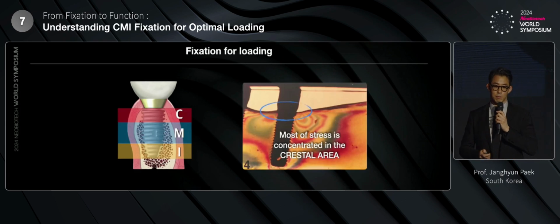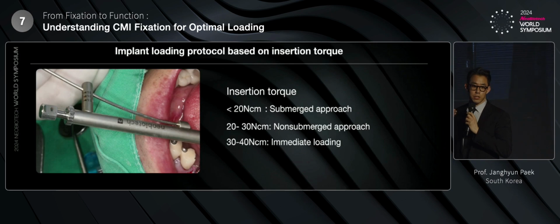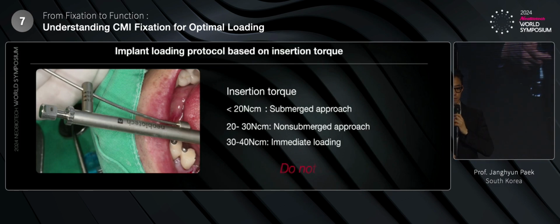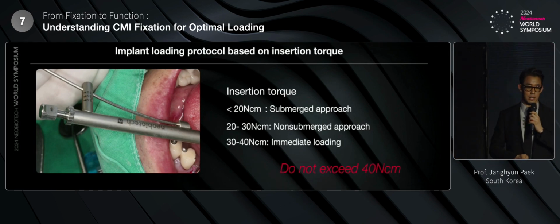So for loading, most stress is concentrated in the crestal area of the implants. Implant loading protocol is based on the insertion torque. With an insertion torque greater than 30 Newton centimeters, 30 to 40 Newton centimeters, we go with anytime loading and immediate loading. However, if the initial stability is less than 20 Newton centimeters, we have to submerge the implant and let it sleep for 3 to 4 months. The most important thing here is do not exceed 40 Newton centimeters.